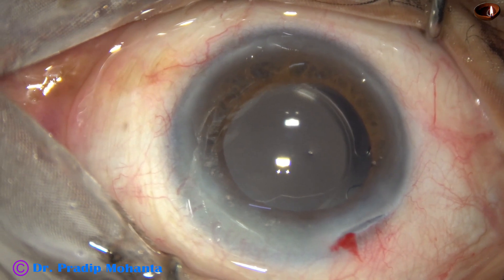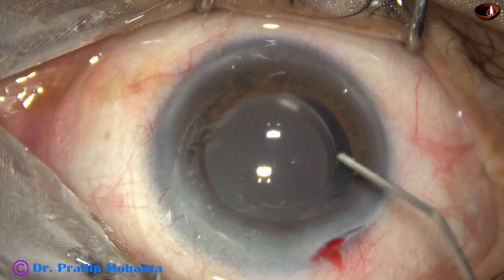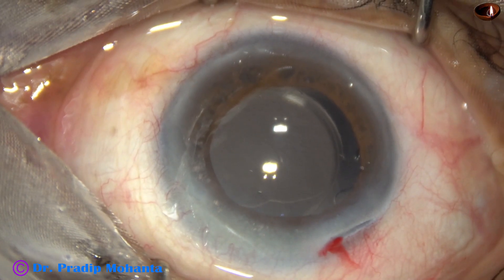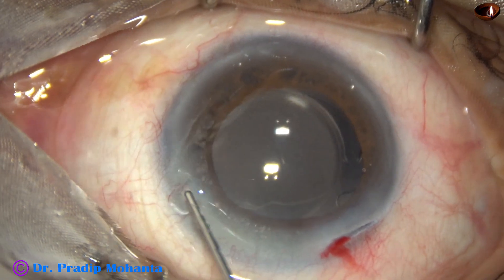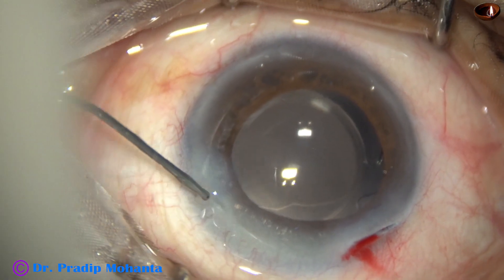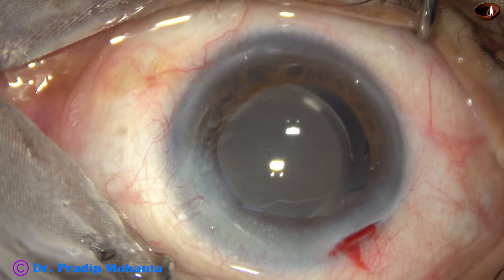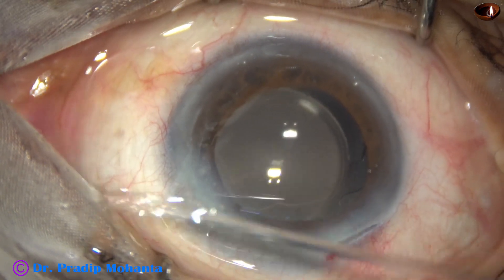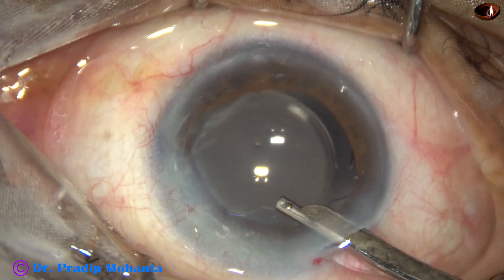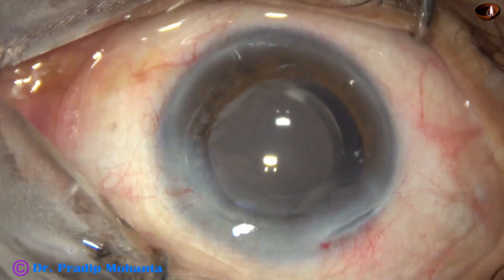A bit of moxifloxacin is injected into the anterior chamber. The side port is closed by hydrating the corneal stroma on either side of the wound, and then the integrity of all wounds is checked. The anterior chamber is formed very nicely, and after confirming wound integrity, the case is concluded.